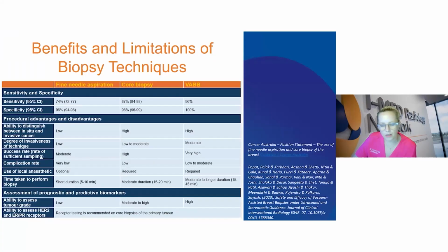This is a combination also from Cancer Australia and also this study around the safety and efficacy of VABs. VABs are a lovely test, and increasingly we are using them in our clinics, not just under mammography, but also under ultrasound. And you can see the sensitivity and specificity in this study was amazing. The upgrade rate at surgery is far lower than any other type of biopsy that we do. But it is more invasive.